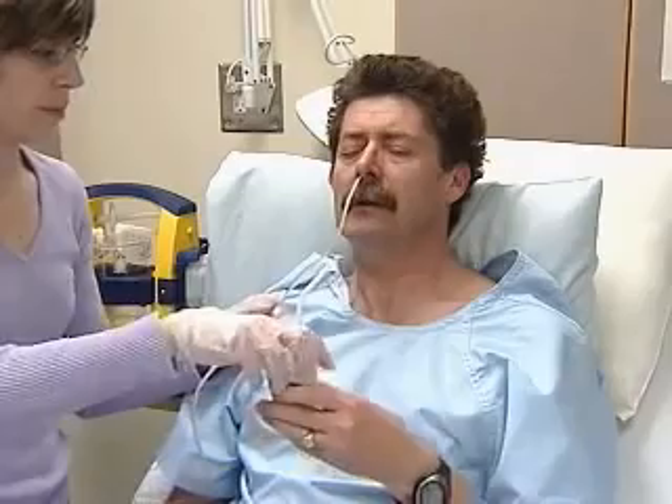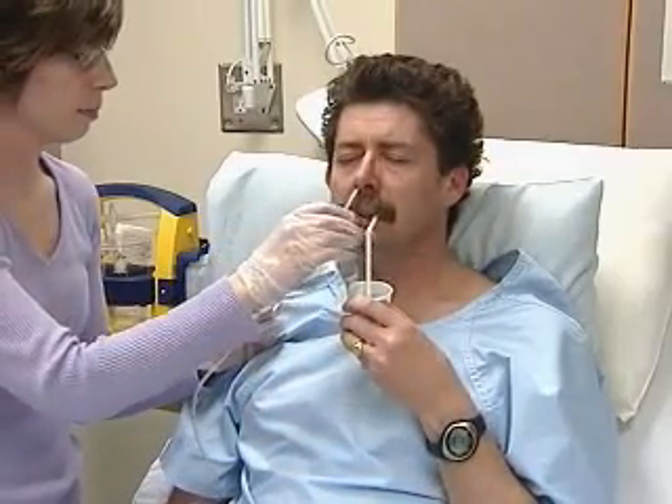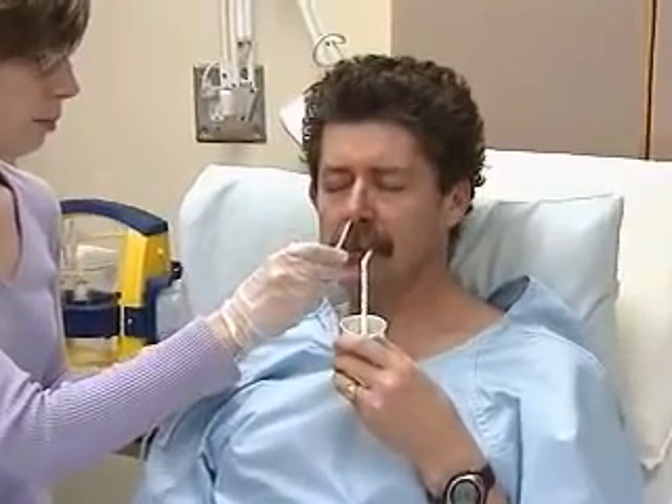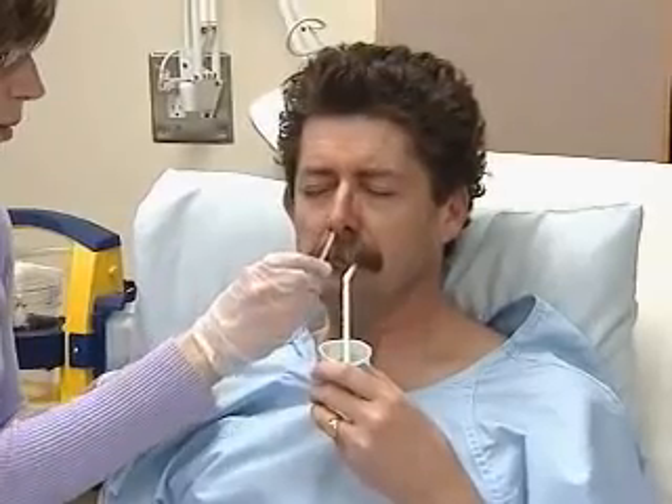At this stage, explain to the patient that he'll have to swallow to help the process along. With the end of the tube now just above the oropharynx, have the patient flex his head forward, take a small sip, and swallow.